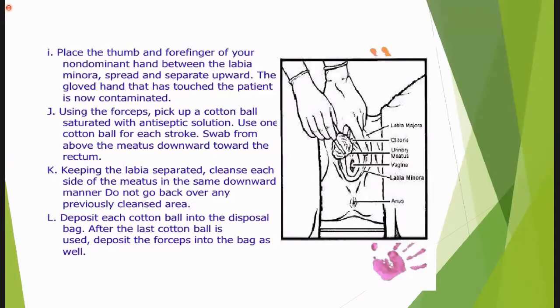If you start from the center, clean the area inward to outward. Okay. Deposit each cotton ball into the disposable bag. After the last cotton ball is used, deposit the forceps into the bag as well.